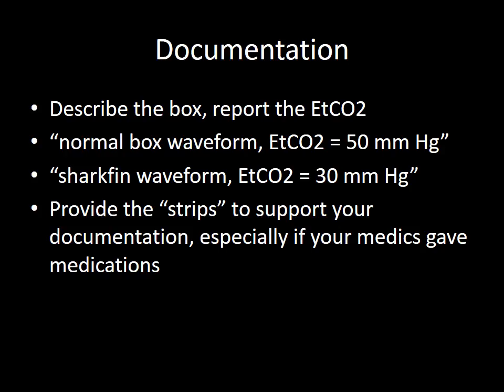For documentation, just describe the box. Do you have a box waveform, or a shark fin waveform, or something else? Report the end tidal, the number. So I normally just write normal box waveform, end tidal is whatever. Provide strips, especially if you're doing an advanced airway procedure, or with COPD and CPAP, where you can show before and after, where you're actually improving. This is just great documentation.